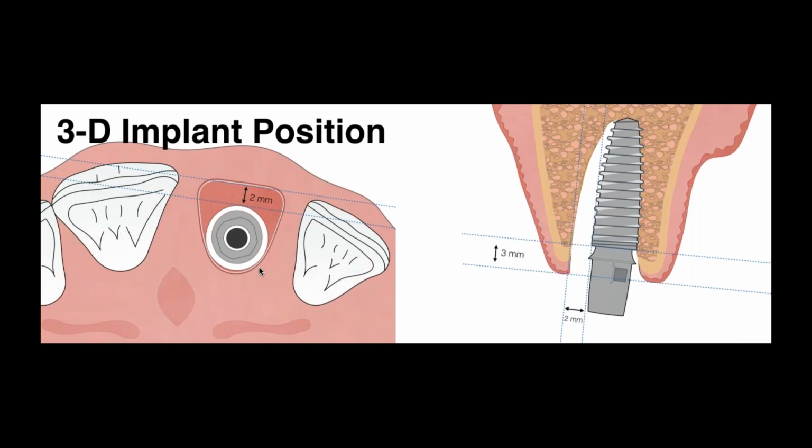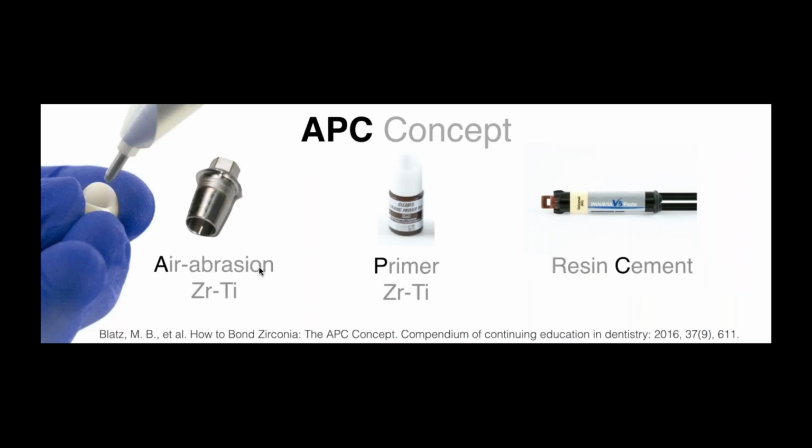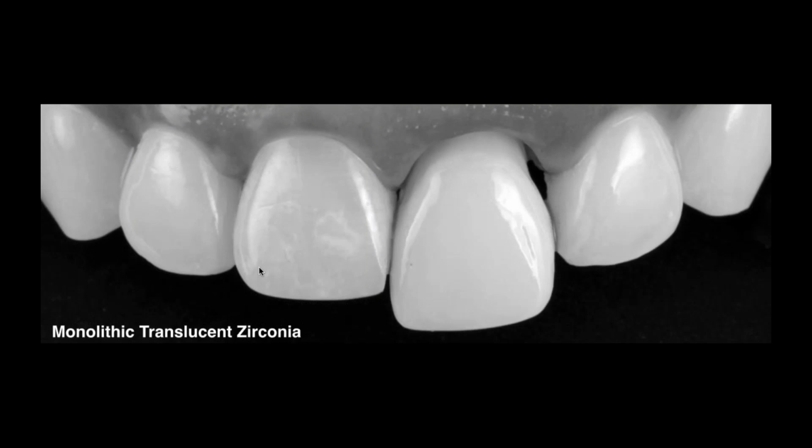So understanding these since the planning phase will also help you have a better clinical success with your implant restorative materials. Okay, and as I said before, the tie base, air abrasion, ceramic primer plus, and composite resin cement. Okay, in this case, we used a monolithic zirconia. And always remember that when we work with monolithic zirconia, we're using one of the most biocompatible materials out there. Zirconia is being used longer in orthopedics than in dentistry. For hip replacement, it's very strong and very biocompatible. So that subgingival area, we always want to make sure we avoid any glaze down there, and we just polish manually that surface.